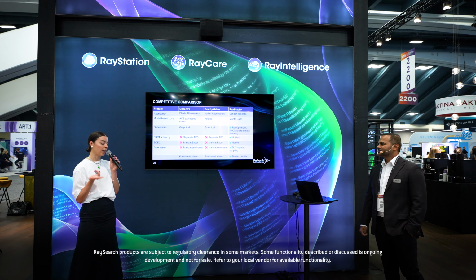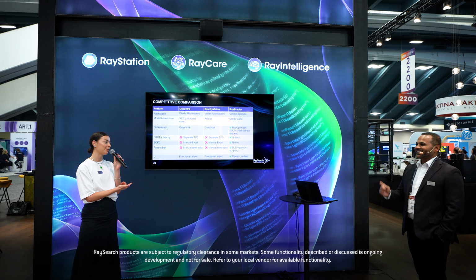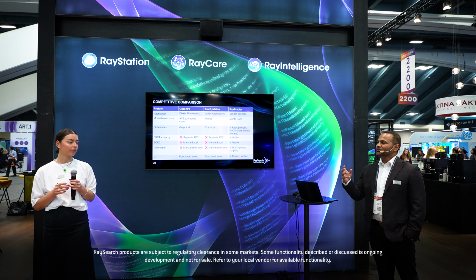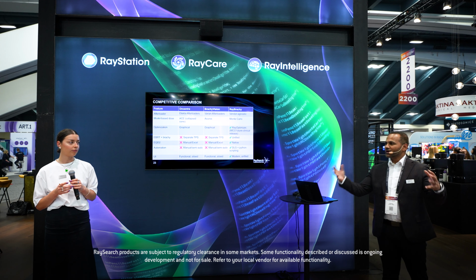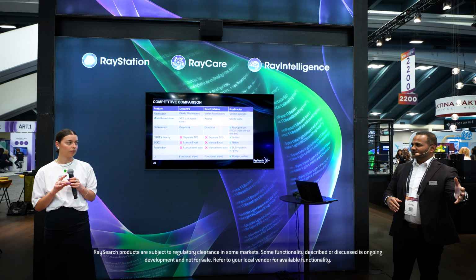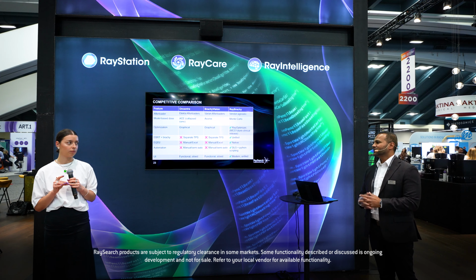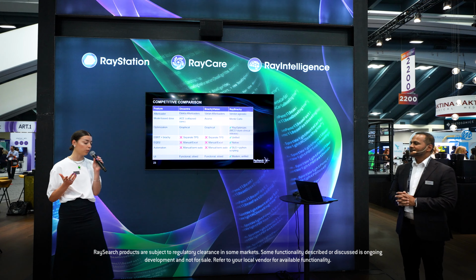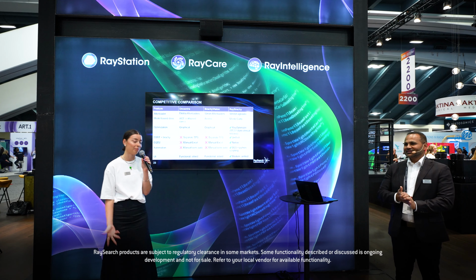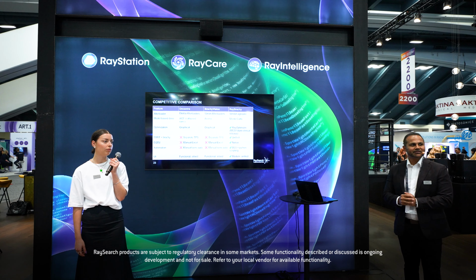Yes. And neither scripting nor deep learning segmentation was created for brachytherapy specifically, right? Yes, and I'm glad you brought that up, because having brachy in the TPS with RayStation, you take advantage of all the development that's happening around treatment planning, right? So the deep learning segmentation and then the 2 Gy equivalents that you get. So front end and back end of all the improvements, and then you have RayBrachy in the middle that's taking advantage of that. Exactly. And anything else that will be developed and integrated into our software will also be available for brachy planning as well. Yeah, and that's the advantage of not being siloed, right? Having that unified application there.